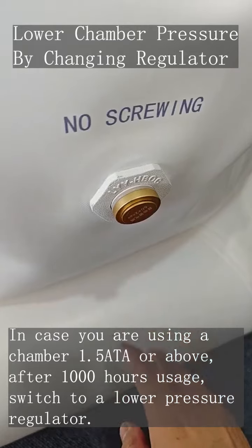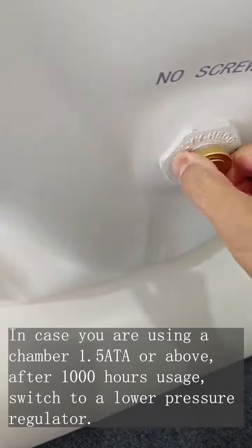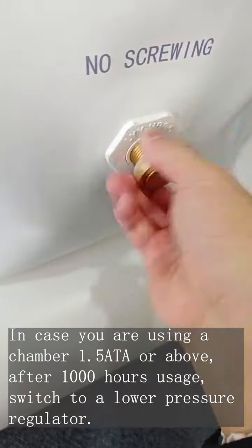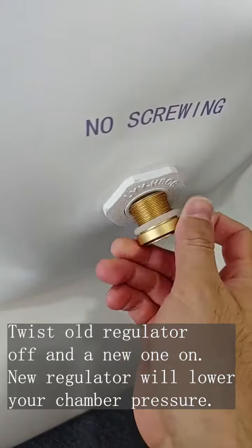In case you are using a chamber 1.5 ATA or above, after 1,000 hours of usage, switch to a lower pressure regulator. Twist old regulator off and a new one on. New regulator will lower your chamber pressure.